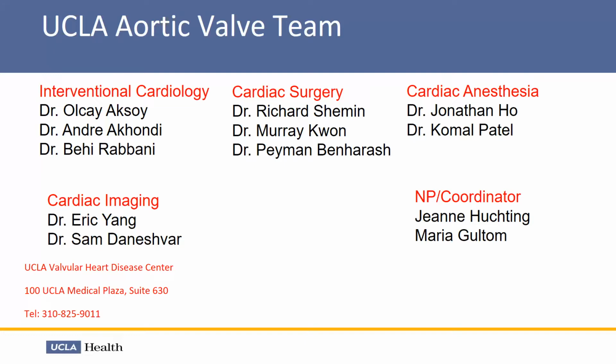So this whole concept of lifetime management of aortic stenosis is really being debated around circles, because you want to put the valve lower so that you can do a valve-in-valve in 10 years, let's say, but then you put a pacemaker in the patient if you put the valve too low. So you're running into these competing interests: I don't want to put in a pacer, but I want to be able to do a valve-in-valve in 10 years. So it's always this debate.